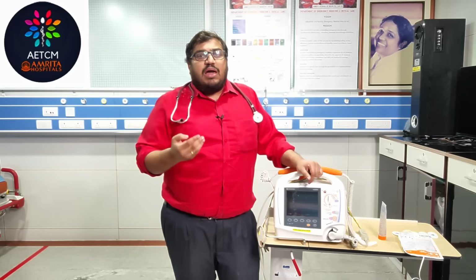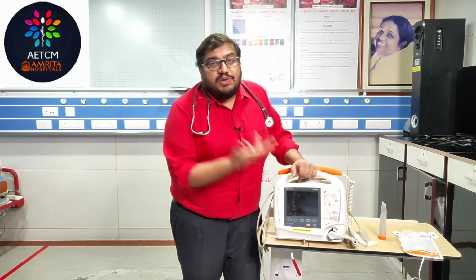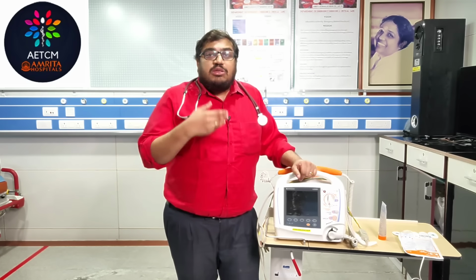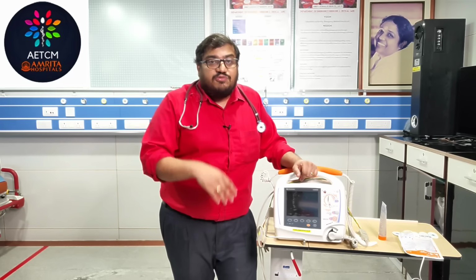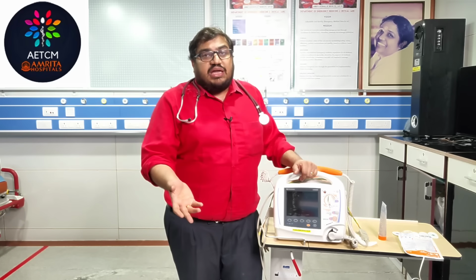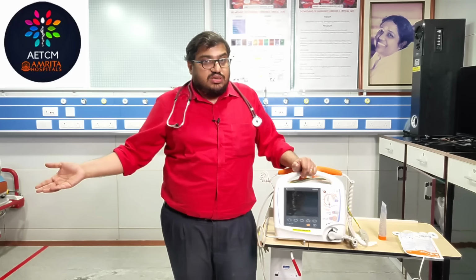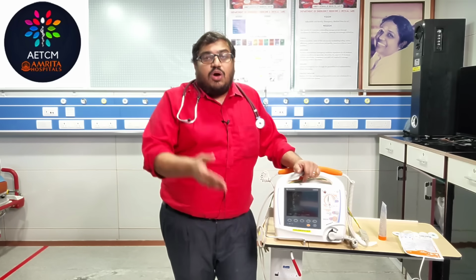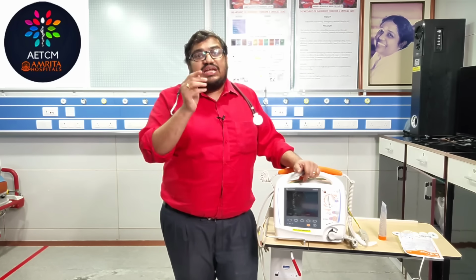What will happen if you don't use synchronization? If you accidentally forget to press the synchronized button, the machine will deliver the shock, but sometimes at the time of the refractory period. As a result, the patient can go into an unstable tachycardia or unstable arrhythmia like VF or VT, and the patient can have a cardiac arrest. Already he is having an arrhythmia, and on top of that, the heart will be in a refractory phase when you are not selecting synchronization.